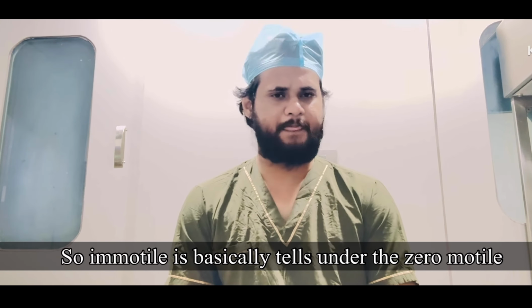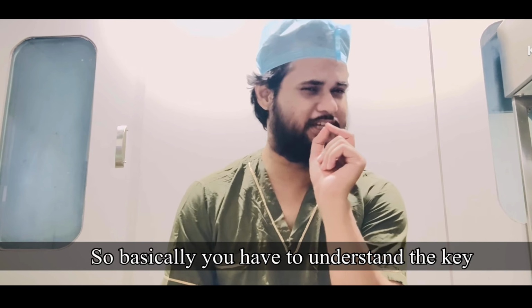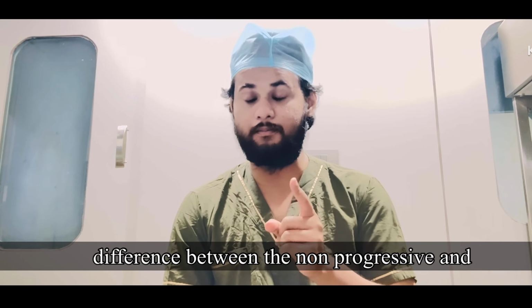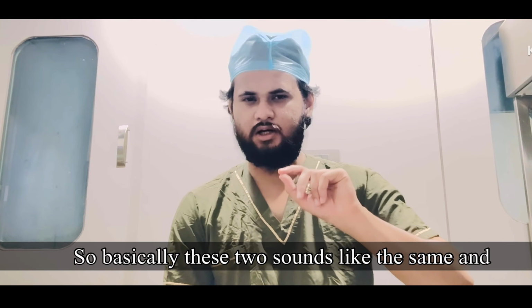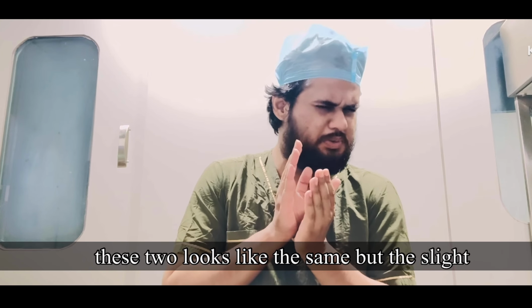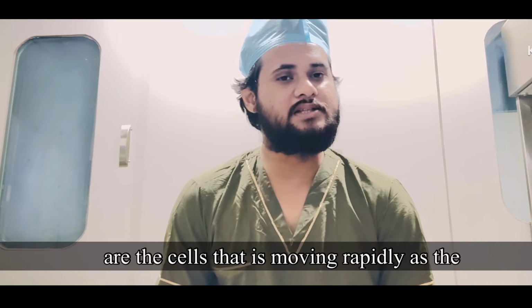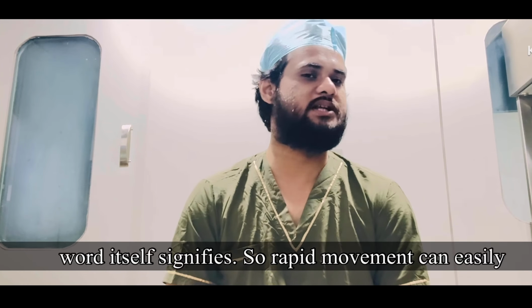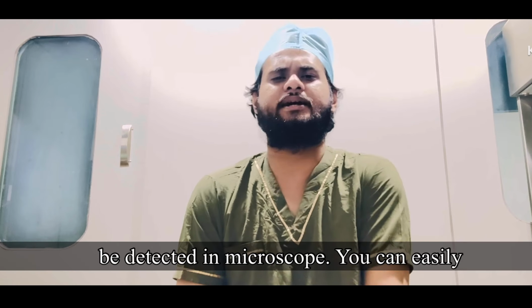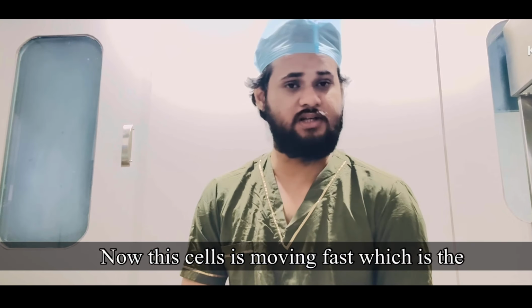Immotile comes under zero motility. You have to understand the key difference between non-progressive and immotile. These two sound the same and look the same, but a slight difference makes them fall under two categories. Rapid progressive cells are the cells moving rapidly, as the word itself signifies. Rapid movement can easily be detected in the microscope. You can easily watch the cells. This cell is moving fast, so this is rapid progressive.